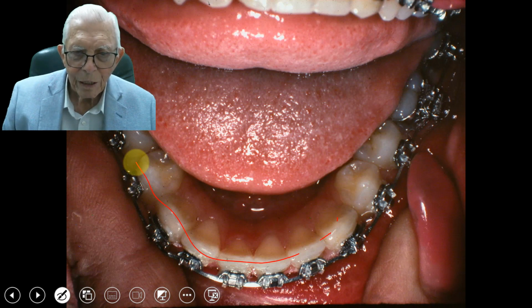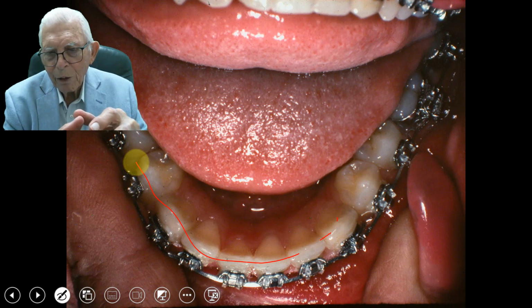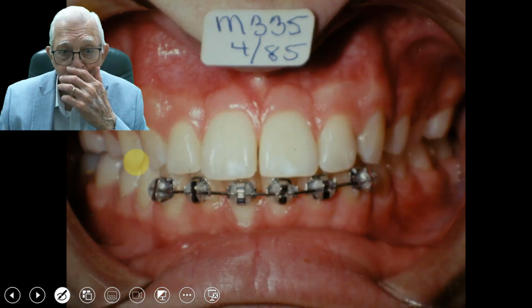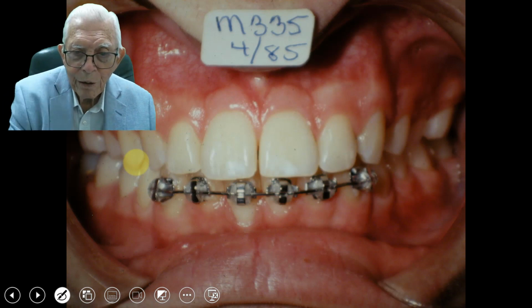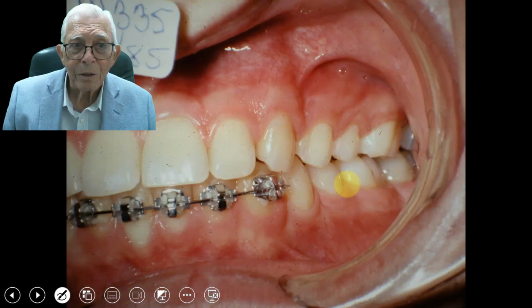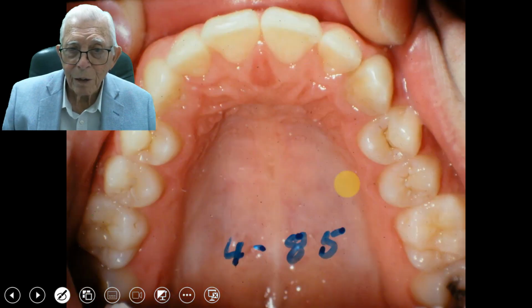So that's where we pull this around, and then we advance the mandible and got it out with the upper jaw fitting like that. So here the young man is, and it took a little longer to do that, but we left a retainer back into here. We put that on there to keep that tooth in place. And now this is the finished part of the case, 1985. And we've got him lined up like that.